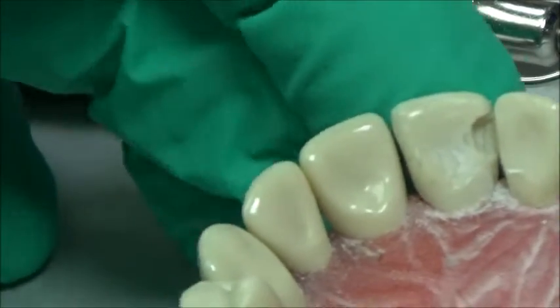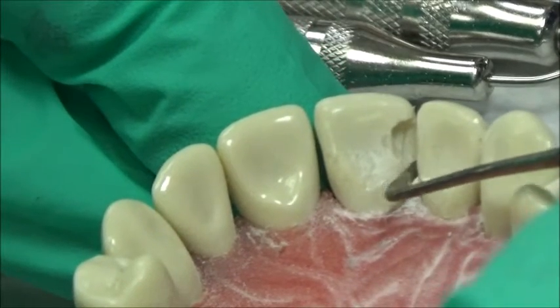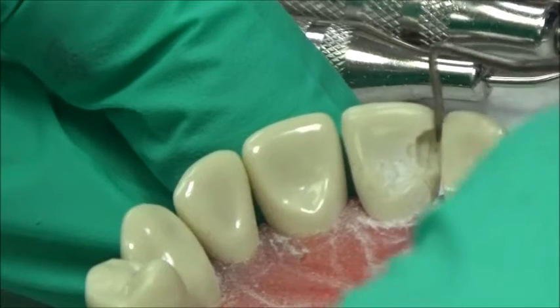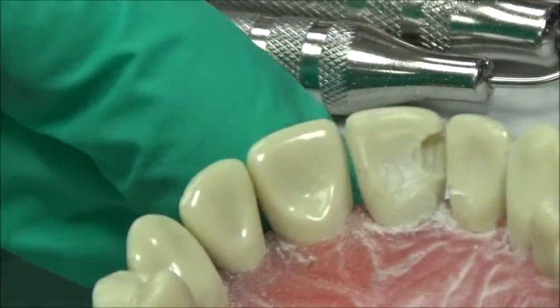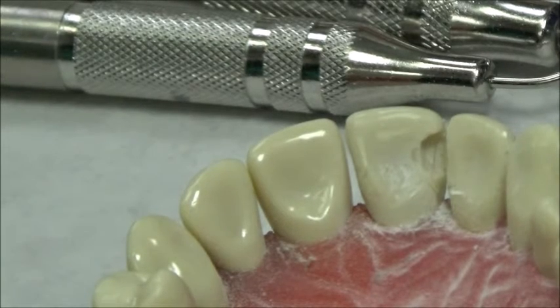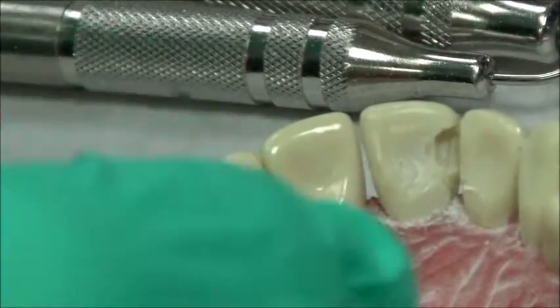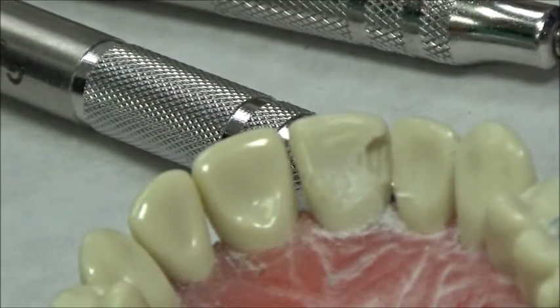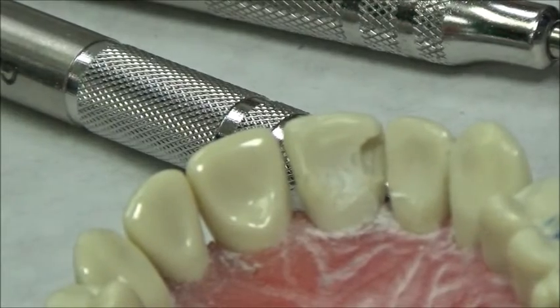Let's check back with the IPC — it pretty well slides through on the facial, and it's a little tight but I can get it through on the incisal. Now that we've got the outline pretty much done, we need to smooth things up. The first thing is the enamel bevel — we'll place that with either a 7404 or a football diamond bur, which is used for crown preparations.